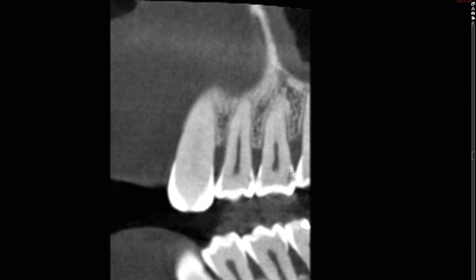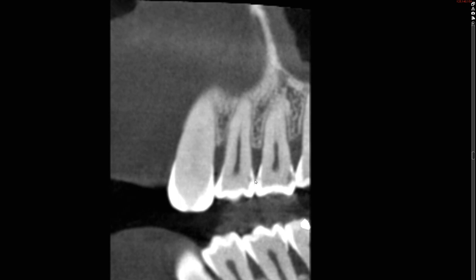Most definitively, the distal of 13 is the lesion I want you to recognize. I'm a little careful to call it a true lesion because cone beam CT is very prone to beam hardening and different types of artifacts. Luckily in this case, it doesn't appear we have metallic or composite restorations. If we did, it could cause significant artifact and be mistaken for caries. I try not to mention dental caries on cone beam definitively unless I'm very confident. The patient doesn't appear to have any major restorations in the maxillary arch, so when you see this, it is highly suggestive of decay — I'm pretty much 100% confident.